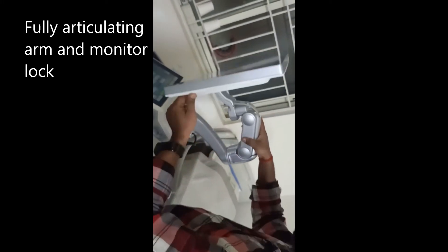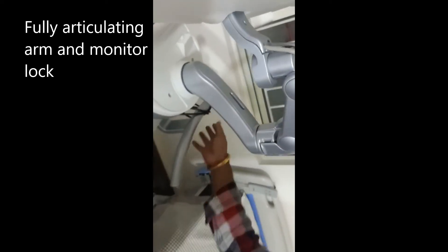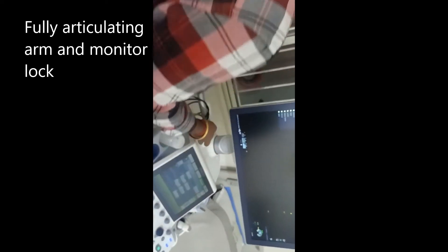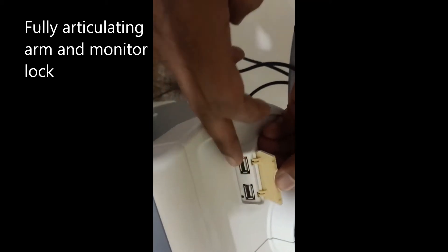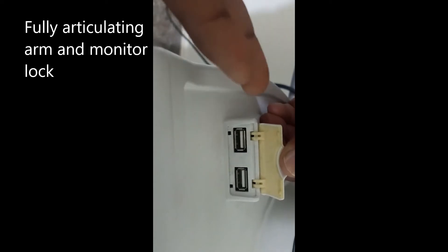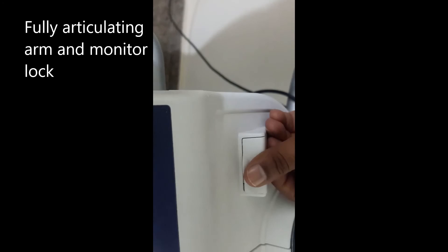Here you can see the USB port, and you can use it for data collection and information transfer.